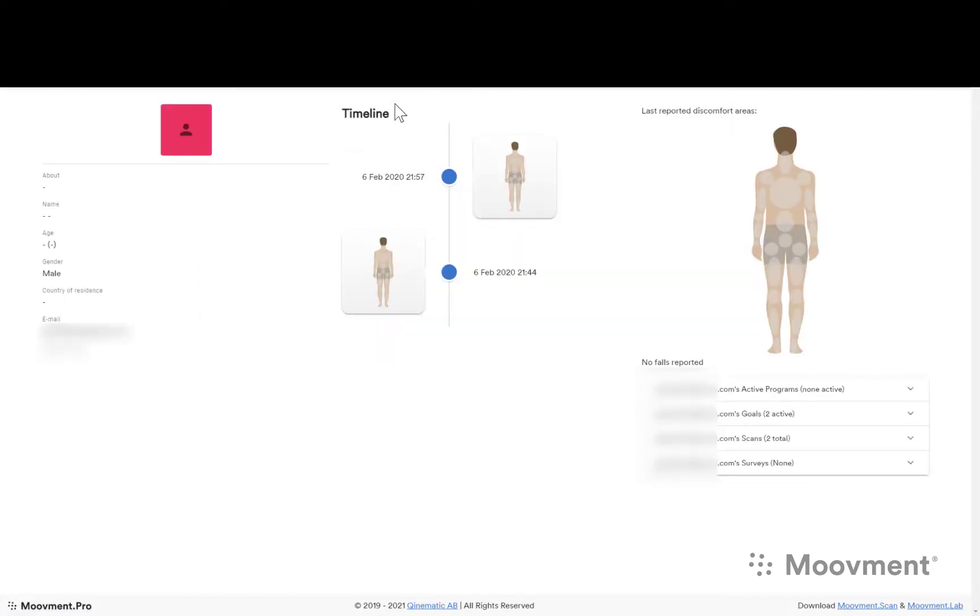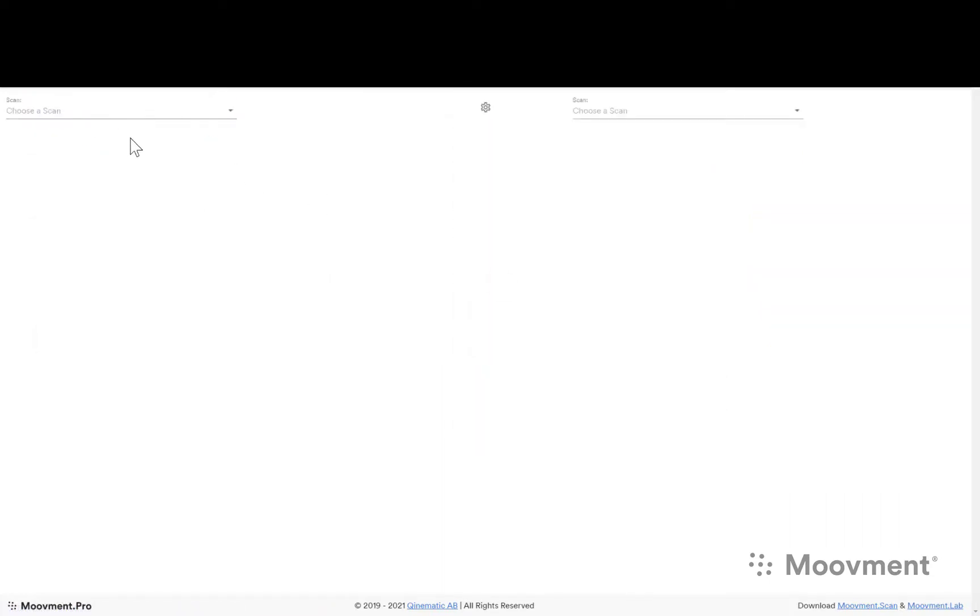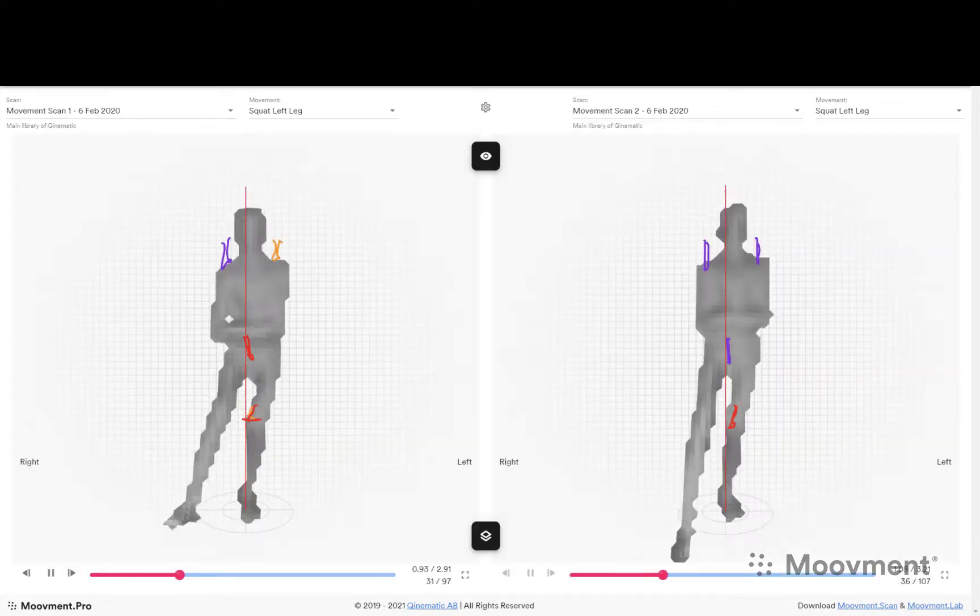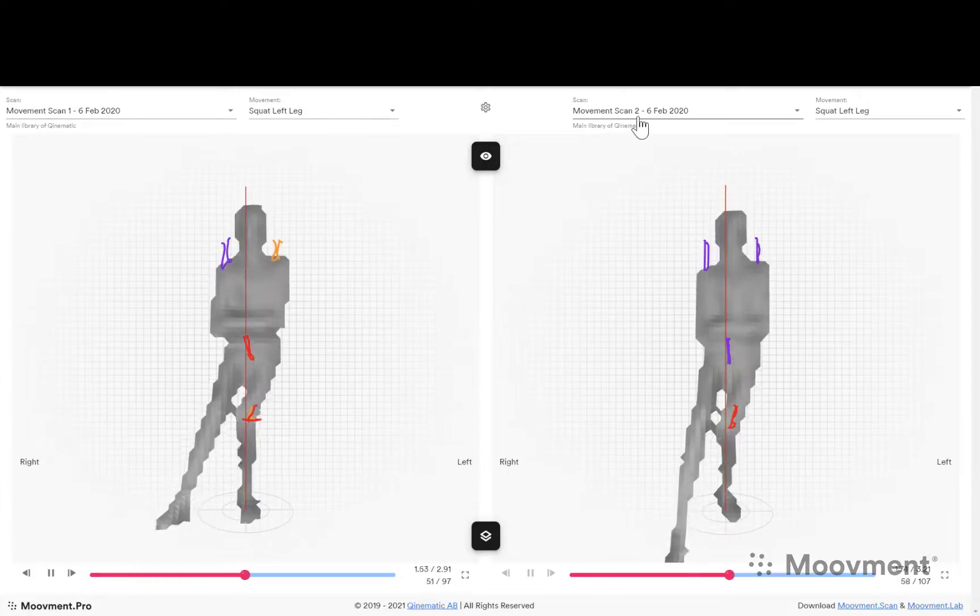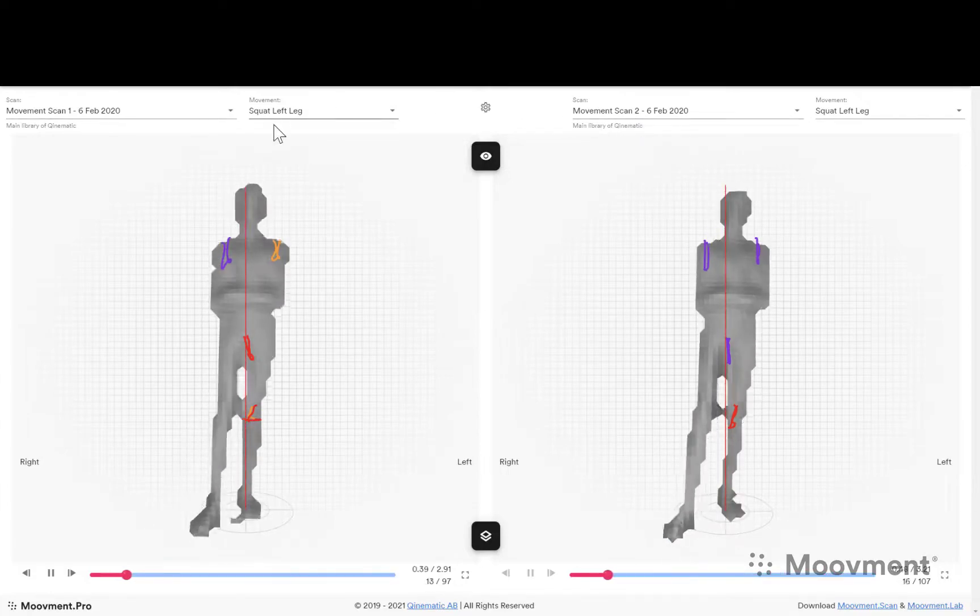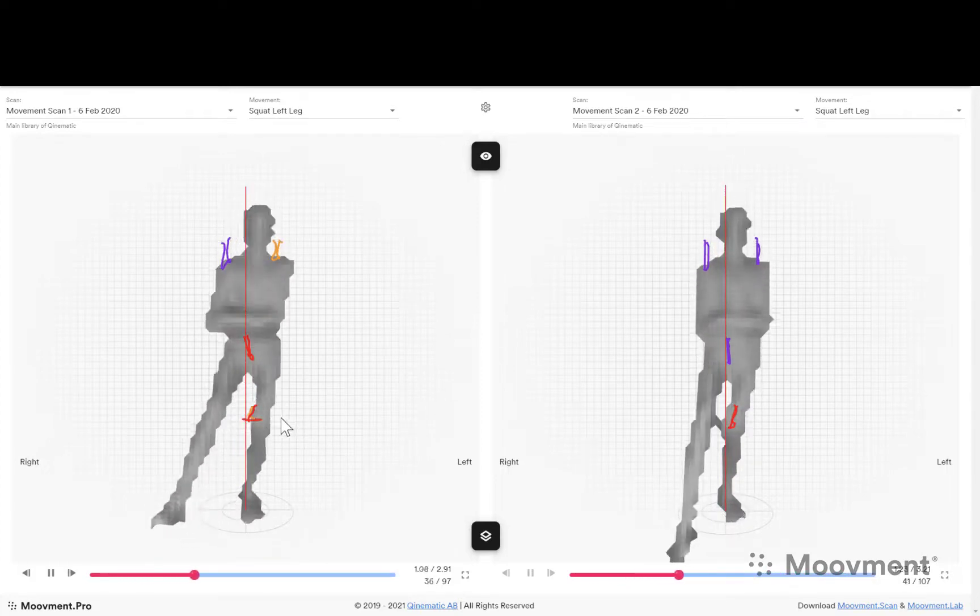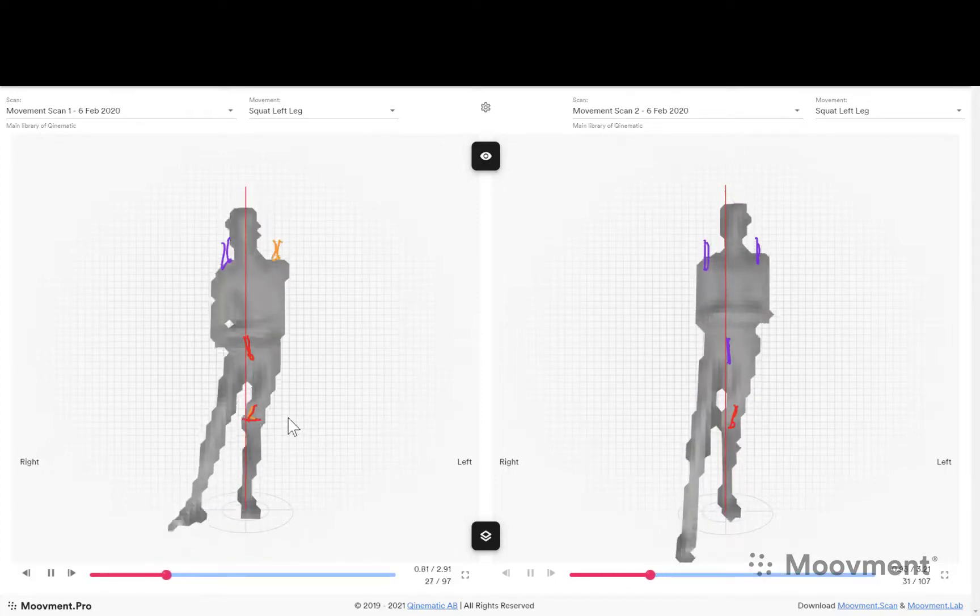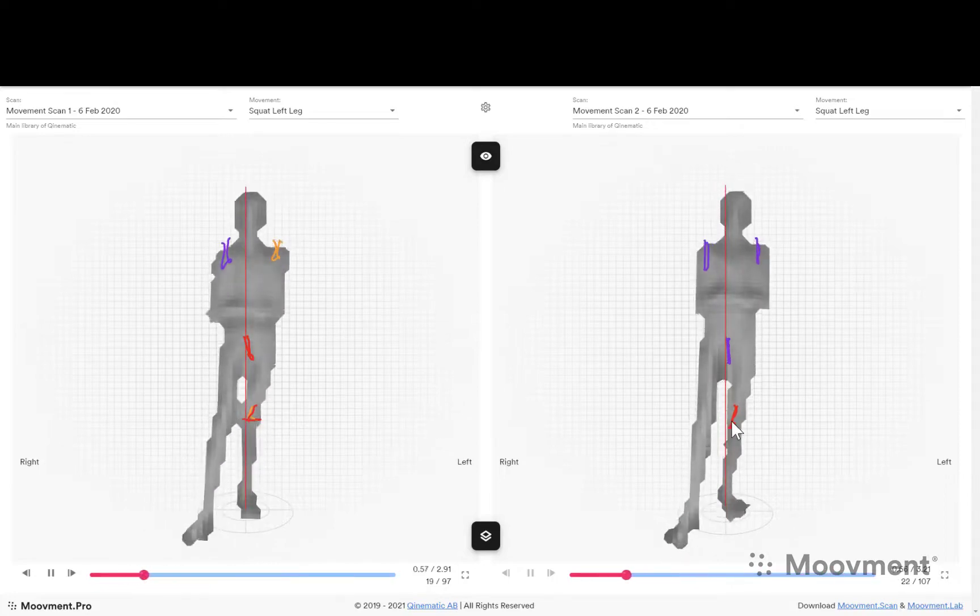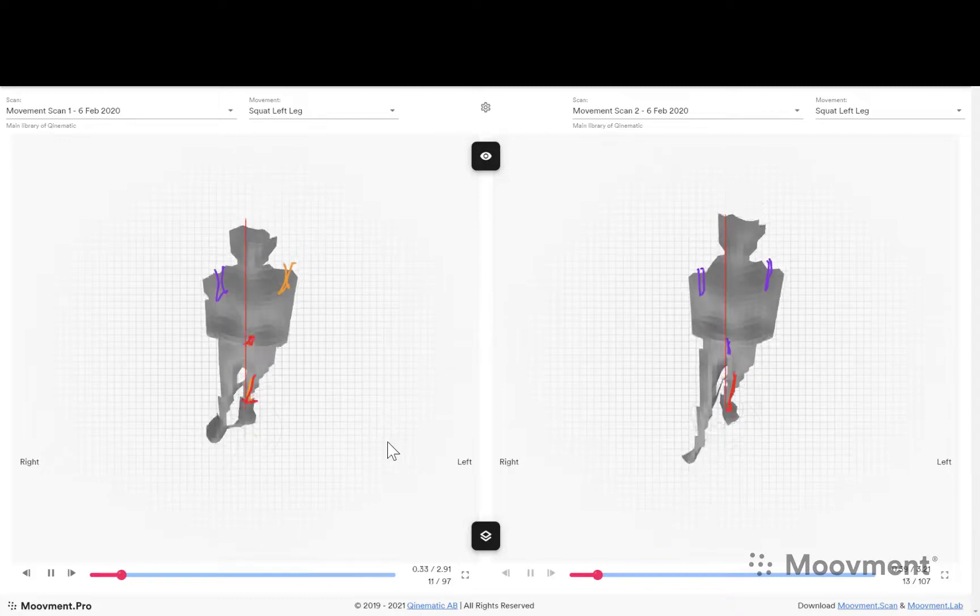You can look at a history of scans that have been done in the past. One of the features that works quite nicely inside of scans is the ability to compare scans. Now with the comparison feature you're able to see scan number one versus scan number two, and you can compare the left squat for both sides. So this was pre-intervention before he was given an exercise to strengthen the external rotators, and this is after.